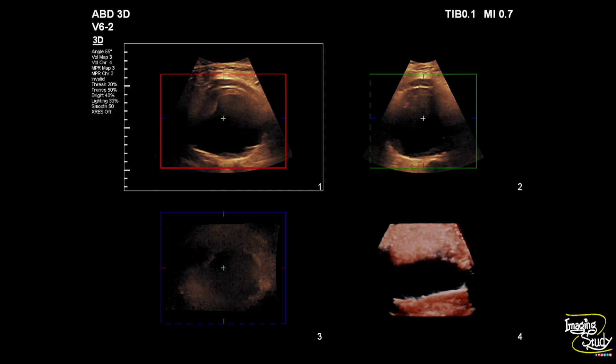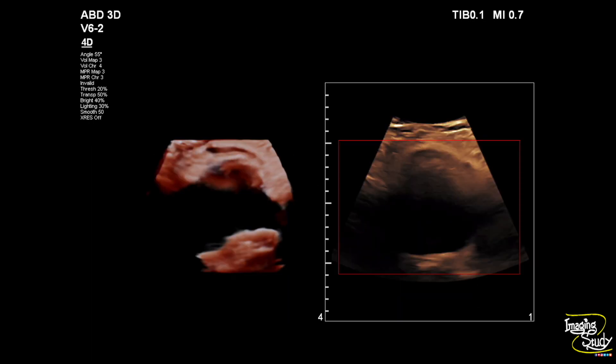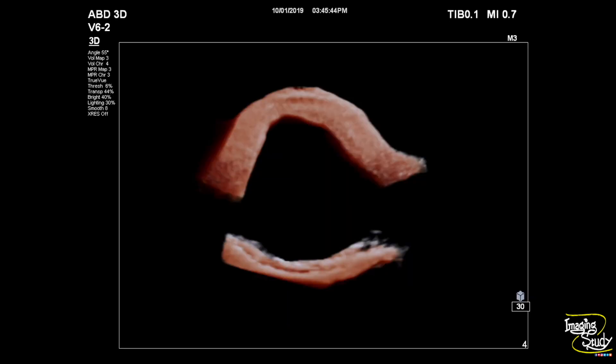We tried to make a 3D ultrasound image of the aneurysm, and here you can see the reconstructed images. This is the last view of the 3D aneurysm, where we can understand the aneurysm is of fusiform pattern.